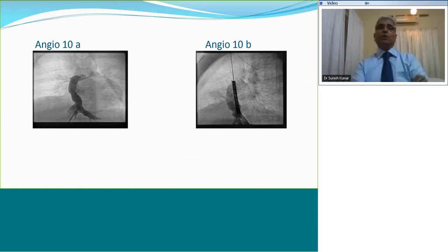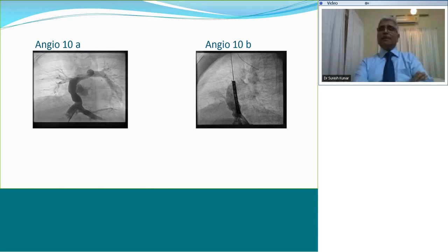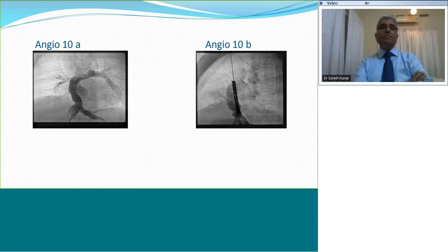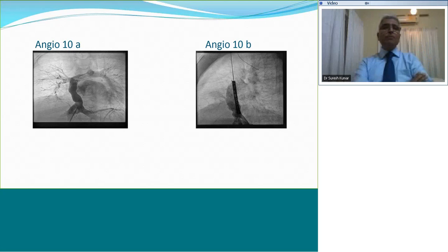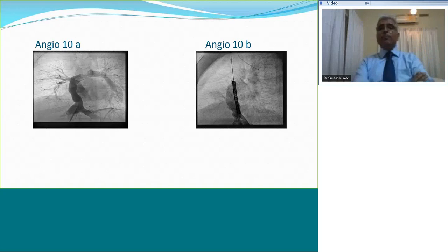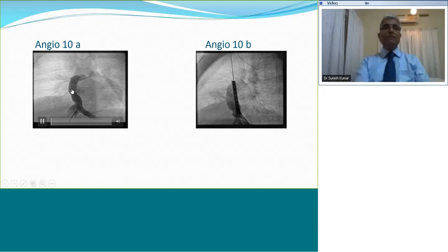Yes, Bhargavi, it is a Fontan angiogram. Excellent. But beyond that, describe that Fontan angiogram. Yes, Parvesh, I'm very happy that you are calling it Fontan, but there is a finding in that, no? What is a little unusual for this Fontan? So in the Fontan angiogram, okay, I'll leave it at that. What do you find in the IVC and the conduit? You're finding a conduit stenosis, you can see here. And this patient had presented with protein-losing enteropathy. It's important to know that to appreciate the second angiogram. Now see the second angiogram.